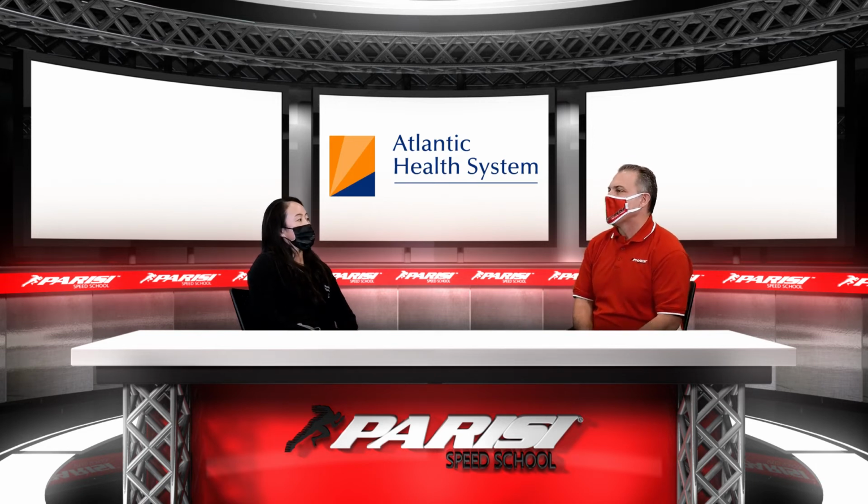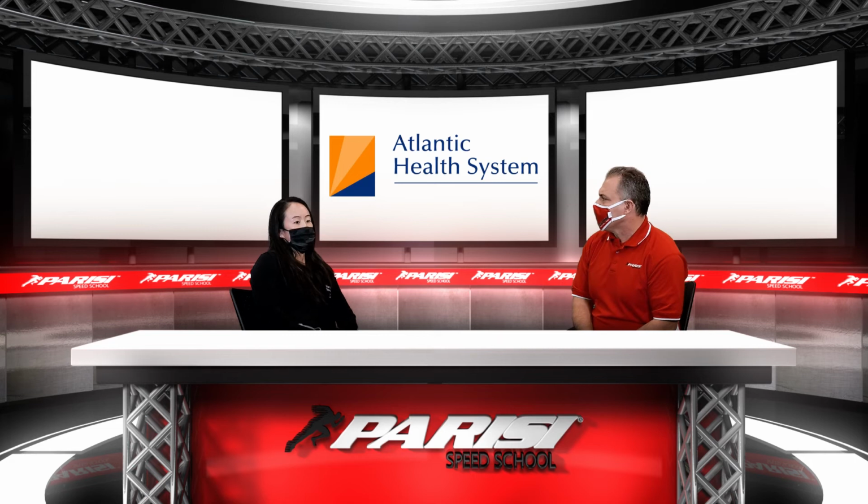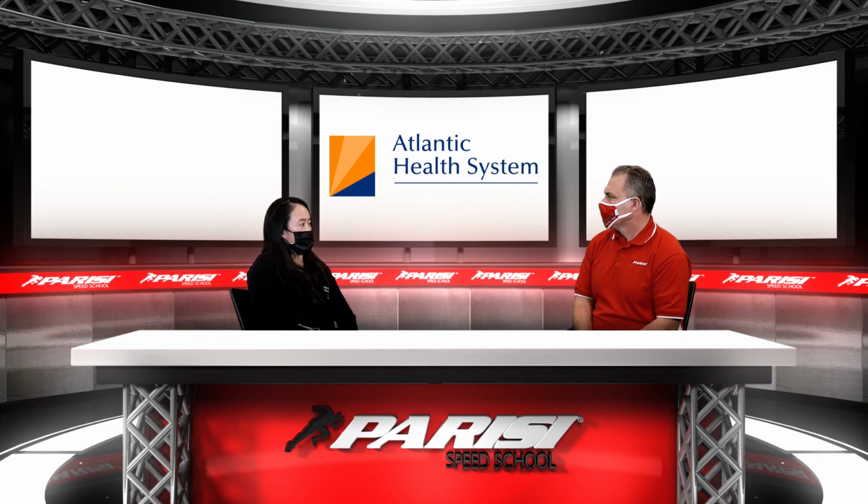Correct. Yeah, awesome. How often should an athlete get tested? So after the initial test, we can retest after about 6 weeks or so. That's typically when you would see a training effect, whether it's an increase in your VO2 max or, like I said, a shift in your anaerobic threshold. That's great. And you do that here, obviously, at Atlantic Health. Yes, Atlantic Sports Health.